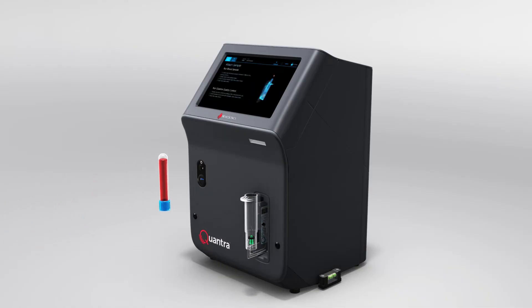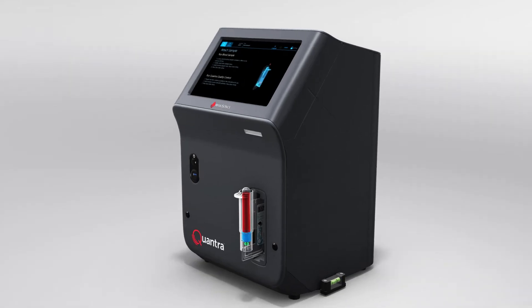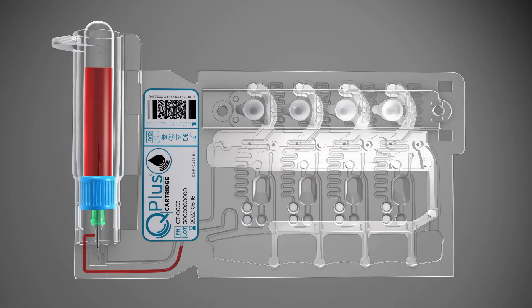The Quantra cartridge-based system is completely closed and fully automated. The blood sample is automatically drawn from the collection tube into the cartridge and warmed.